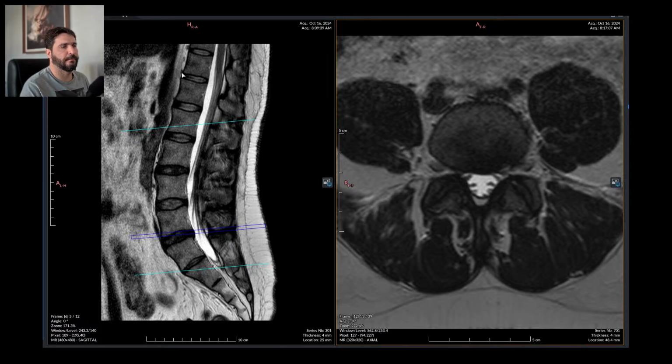It's off. Finished. Let's grab another lumbar spine because reasons. And just checking here my messages. It's all okay.